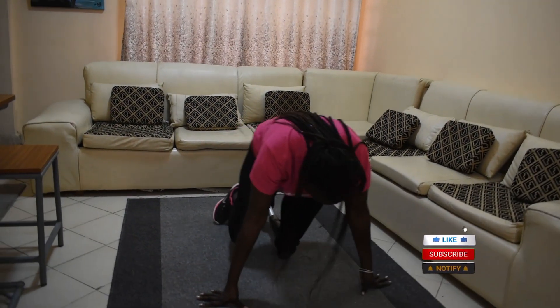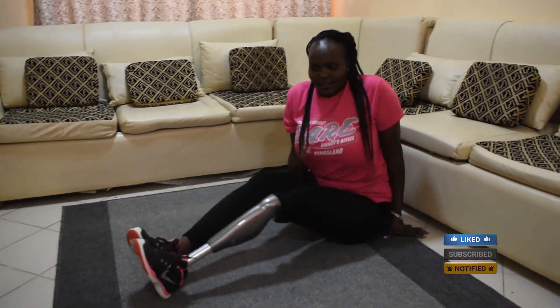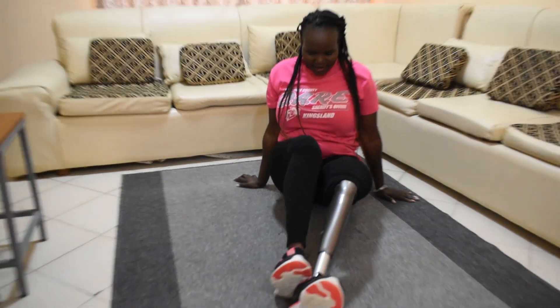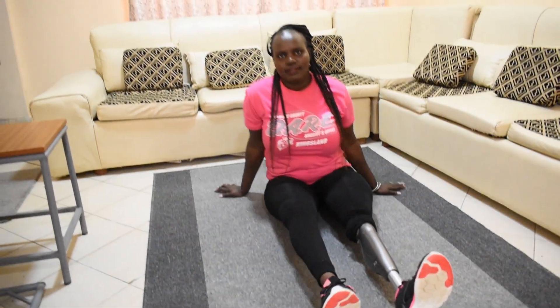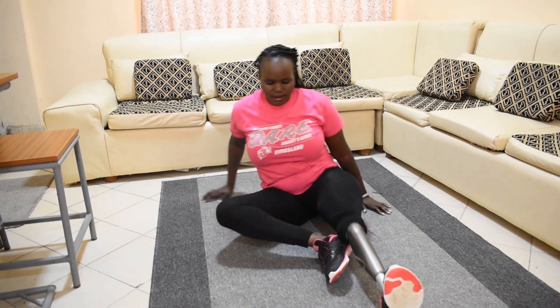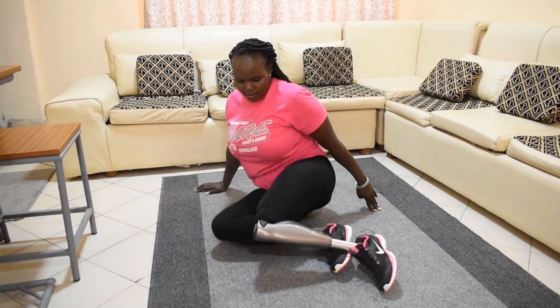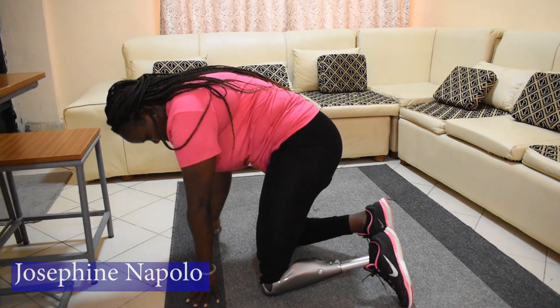Things I came to know about my prosthetic foot: mostly I don't have to walk on a wet or soapy ground, or use shoes without grips.